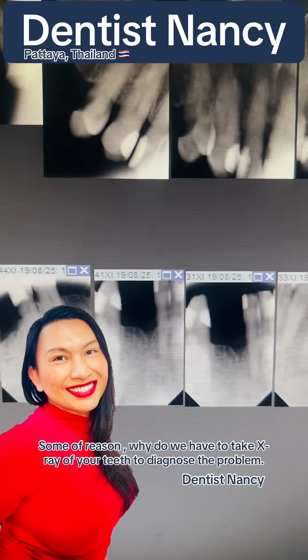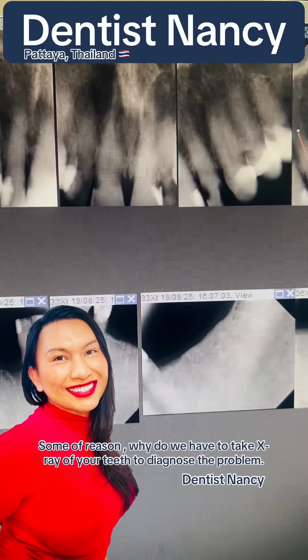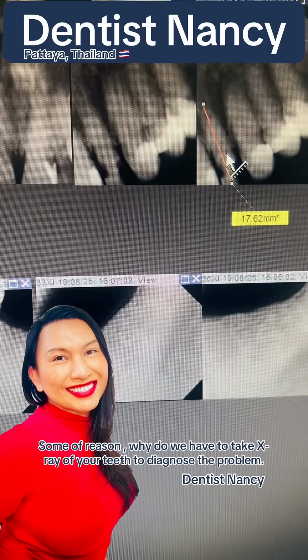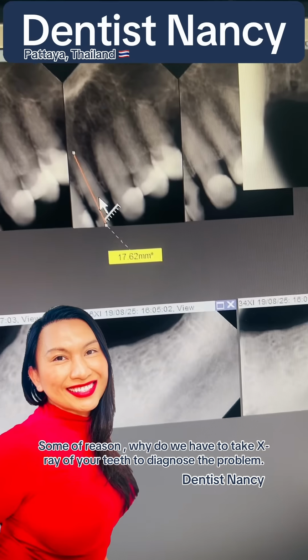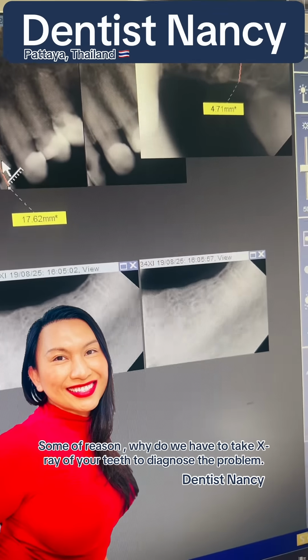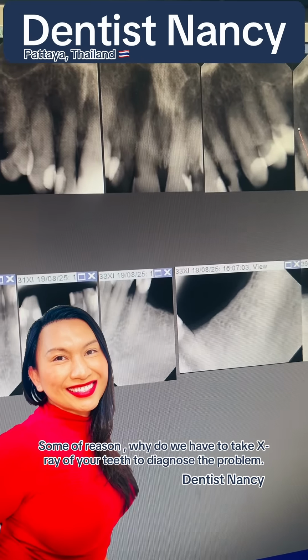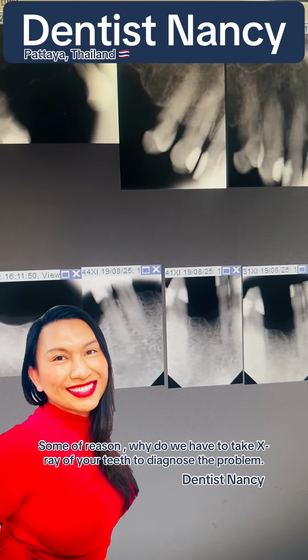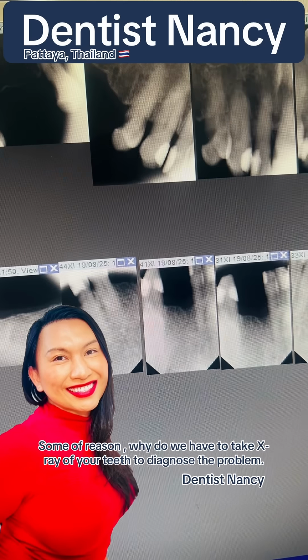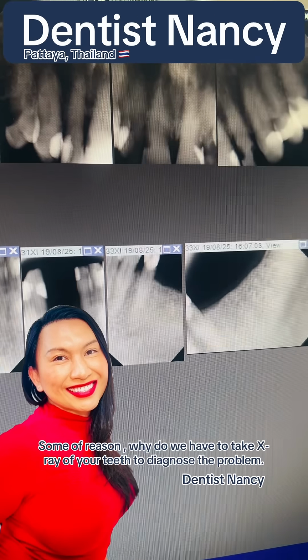Yeah. When we do a dental checkup, it's not just that we look at your teeth and then we're done. We need to check every tooth all around, see how your gum is, and see how everything is. We see so many things. We cannot explain everything that we look at to you. We have to look for everything that is abnormal or suspicious. So this is the reason why we need to take the X-ray for you.